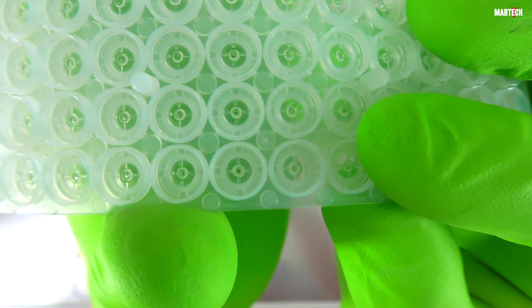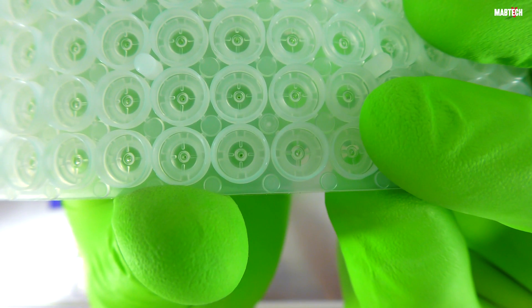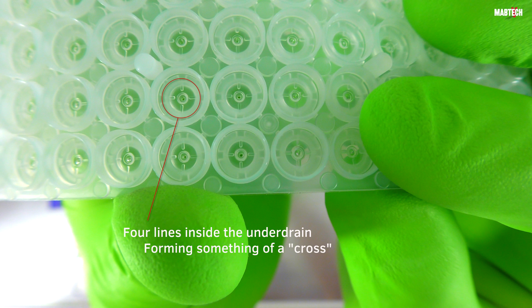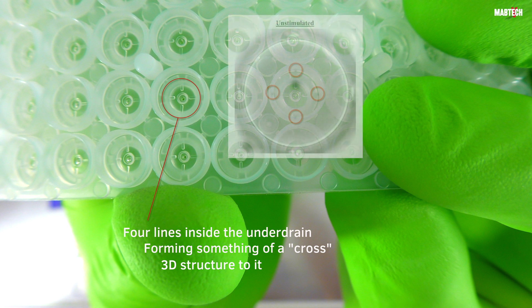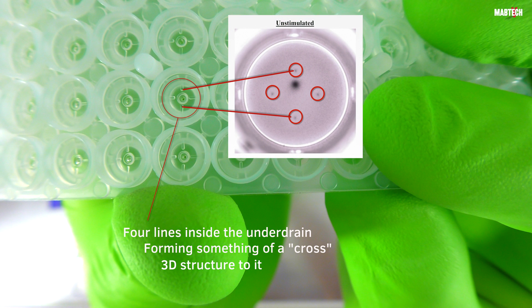Let us freeze the video for a moment right there. See that? Inside of each well, you can see four lines forming something of a cross. However, the cross is not fully flat. It has a 3D structure to it if you look closely.